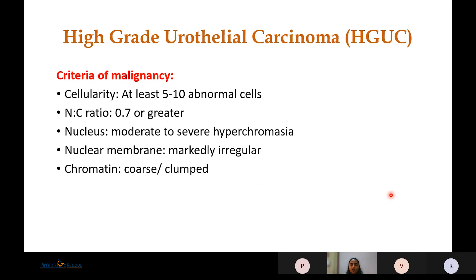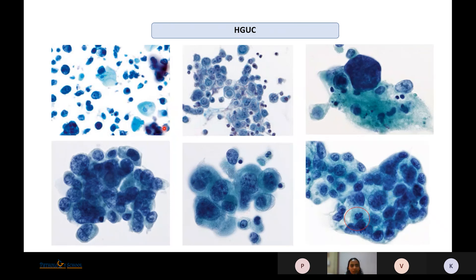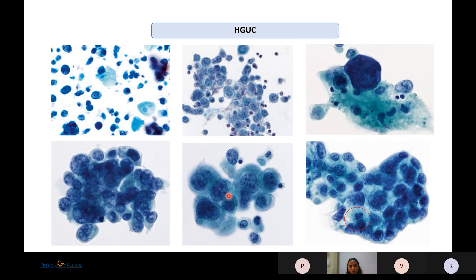High-Grade Urothelial Carcinoma should have at least 5 to 10 abnormal cells. The NC ratio has to be 0.7 or greater, with moderate to severe hyperchromasia, markedly irregular nuclear membranes, and coarse clumped chromatin. If lightly stained, the malignant cells have to be compared with background lymphocytes or benign urothelial cells. There can also be necrosis clinging to the malignant cells, and nuclear details and mitosis are well visualized.